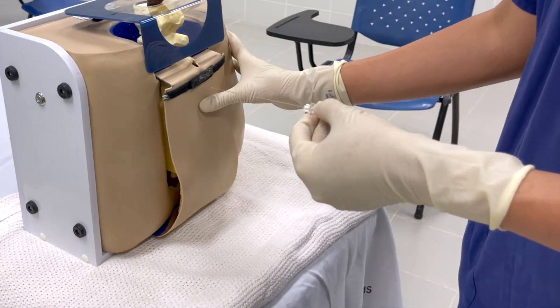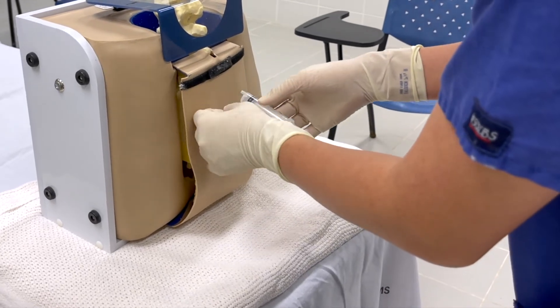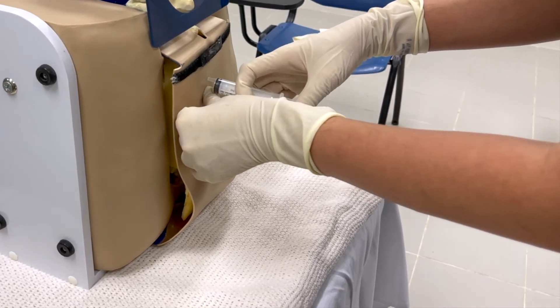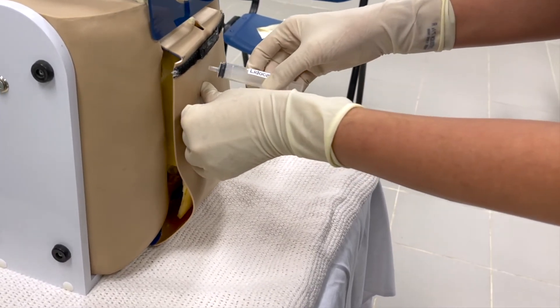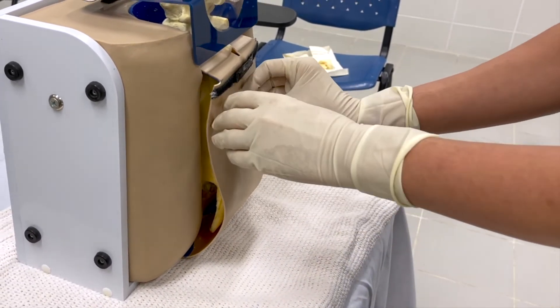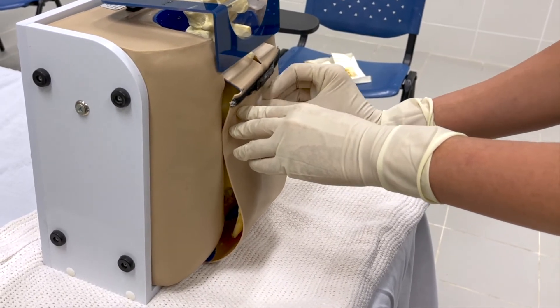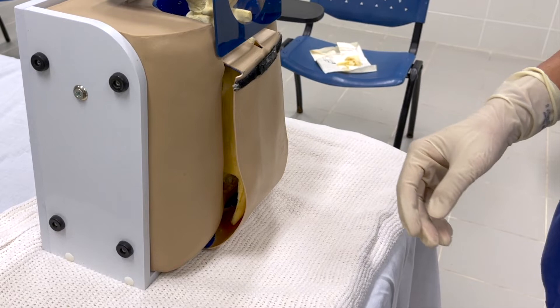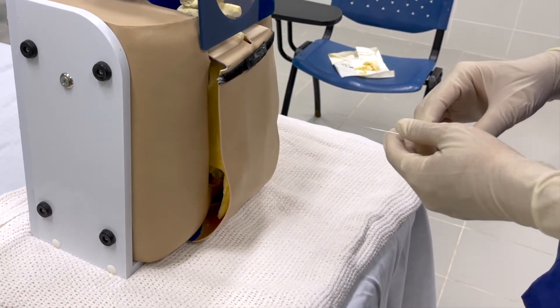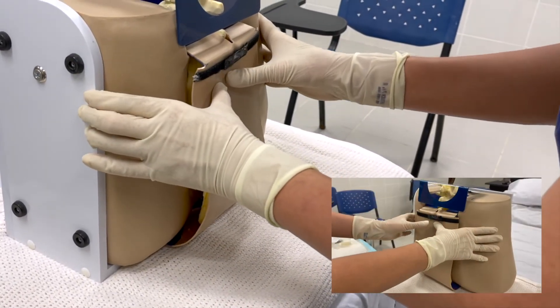Warn the patient that we are going to inject some lignocaine. Mr. Najib, we are going to put some lignocaine around the skin area — you will feel some pain. Apply lignocaine to the skin area, and once done, make sure the local anesthesia is spread around the skin area where we are going to insert the spinal needle.